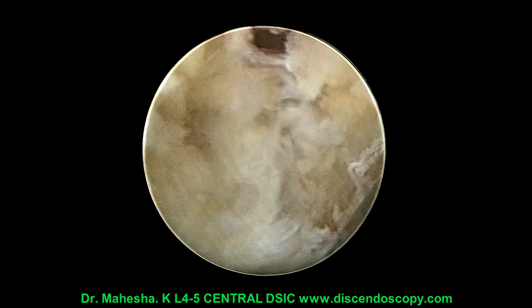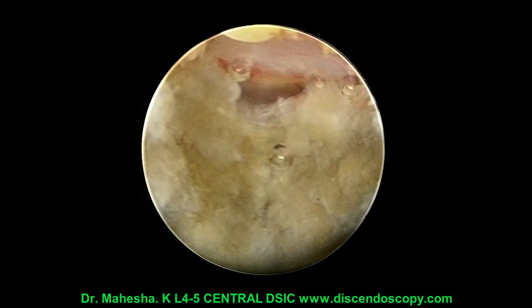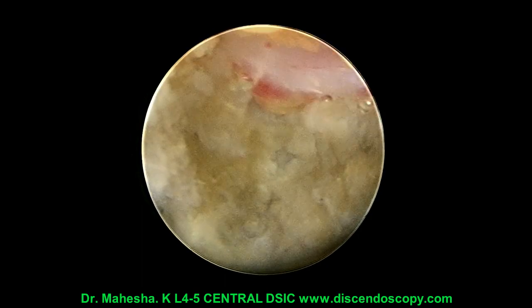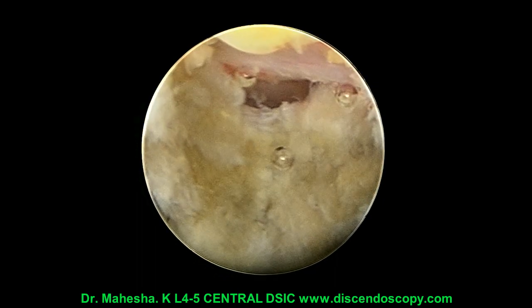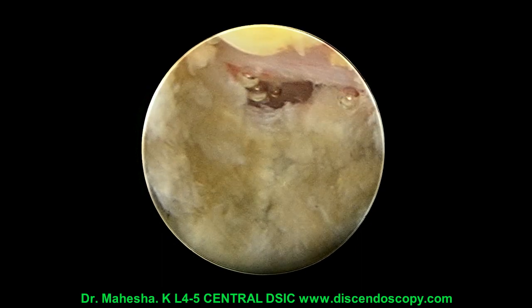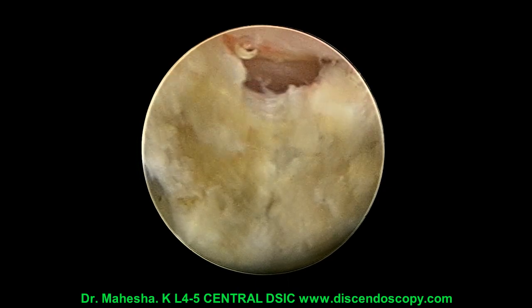Once surgery is complete, you can see the dural pulsations at the top. You can also see the L5 root, which is lateral to the dural sac. You can see that the whole of the disc which was compressing the thecal sac and the root has been completely cleared, and free pulsations of the dural sac is seen.